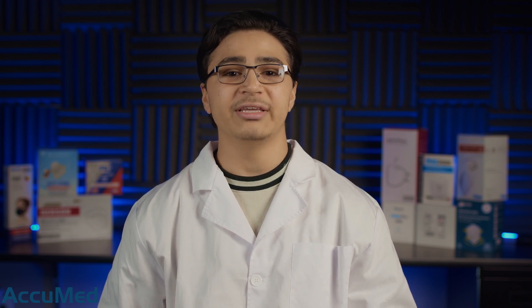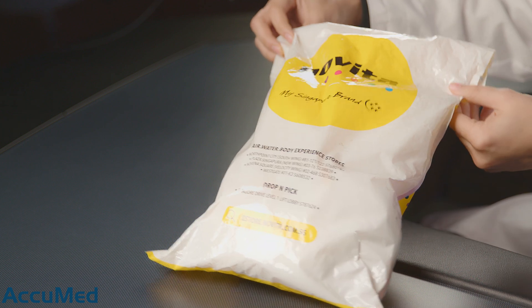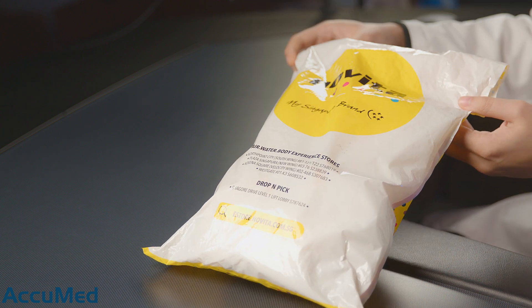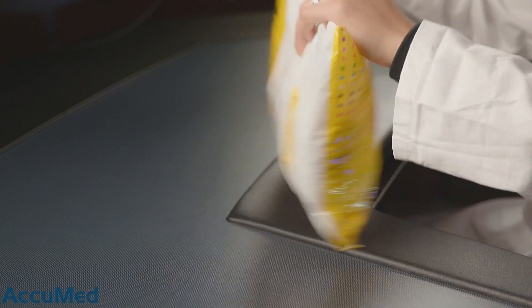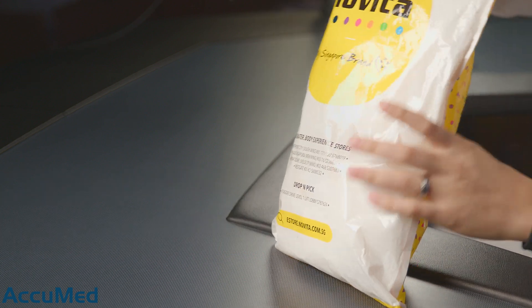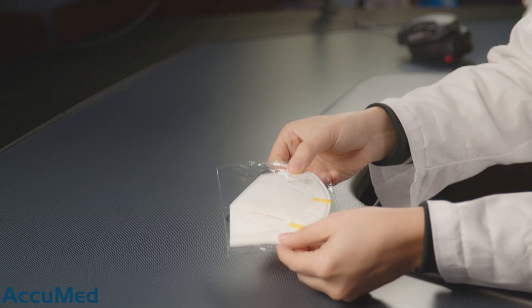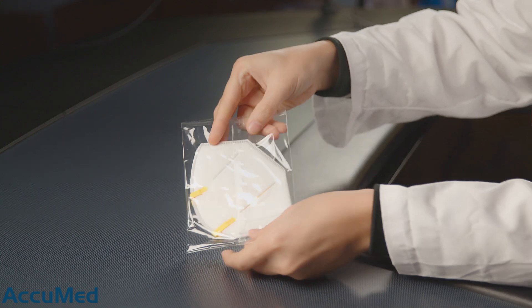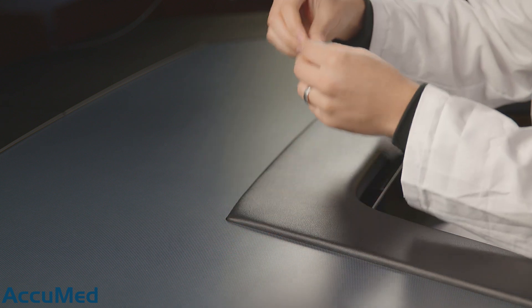Now let's go ahead and look at these before we run them through our TSI machine. Pretty simple packaging — obviously it's a 50 pack for $30, so it's not going to be overwhelming as far as packaging goes. Let's crack these open. They are all individually wrapped just like this.